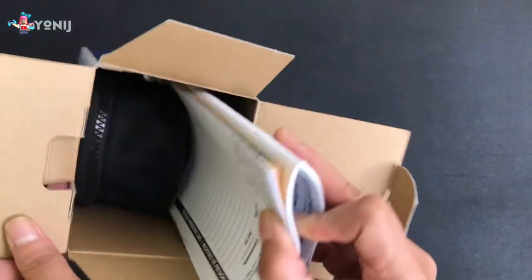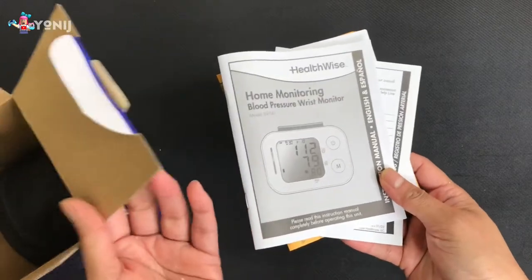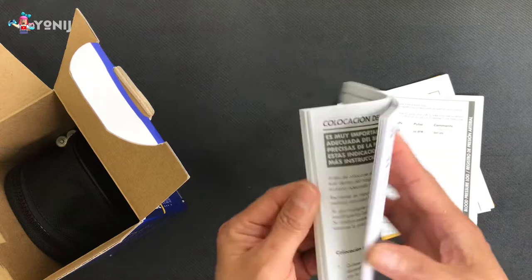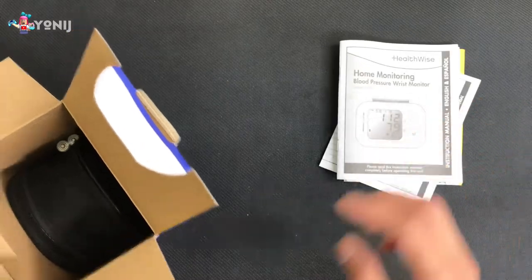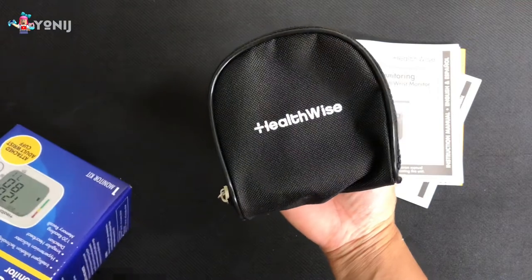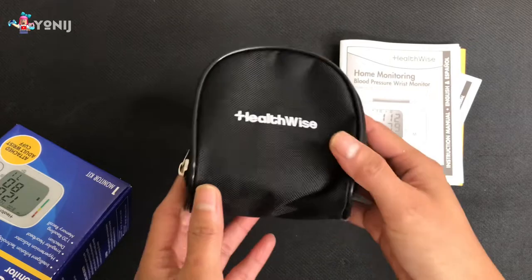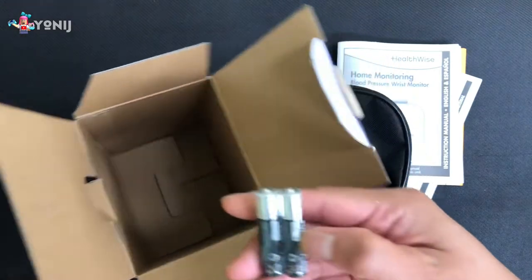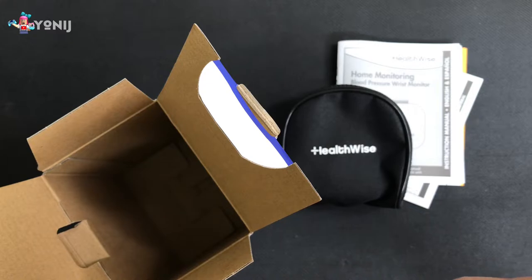So it's pretty small. It comes with guidelines — or really a manual, health guidelines. It's a pretty thick manual. So many things to read, so little time. There we go, we got the manual, and then it comes with a very nice small pouch. Look at how small that is — it fits in my hand. So if you guys are planning to travel with this, it's gonna be super cool.